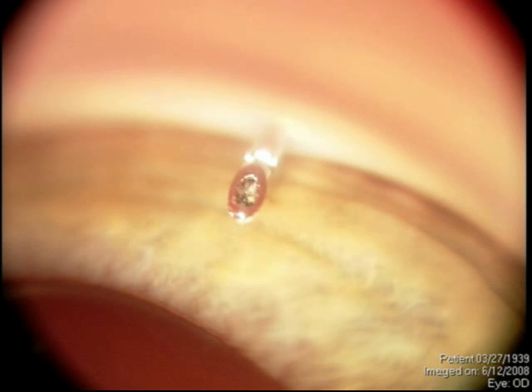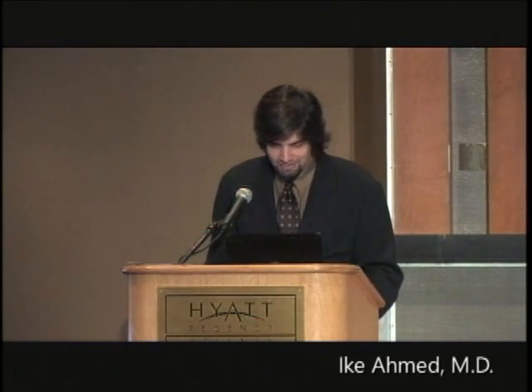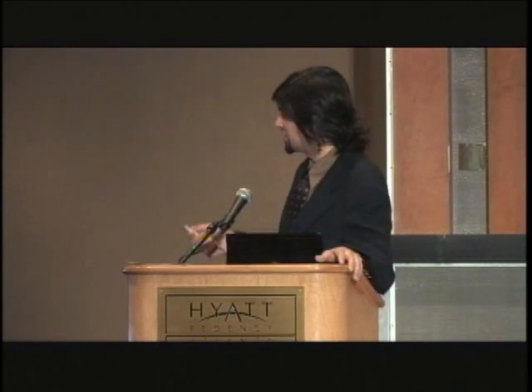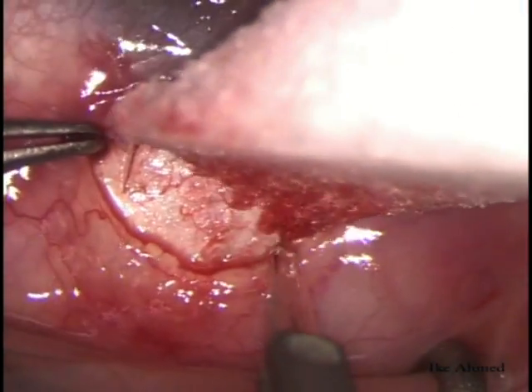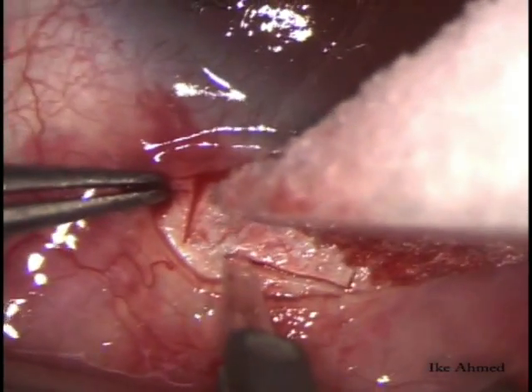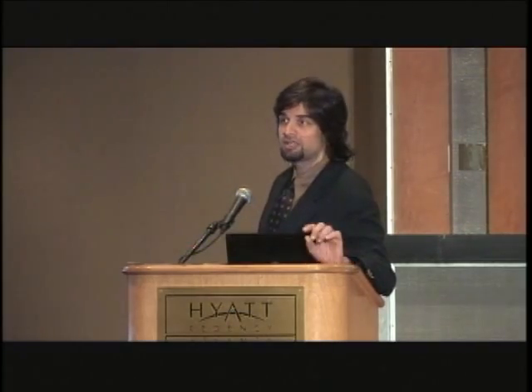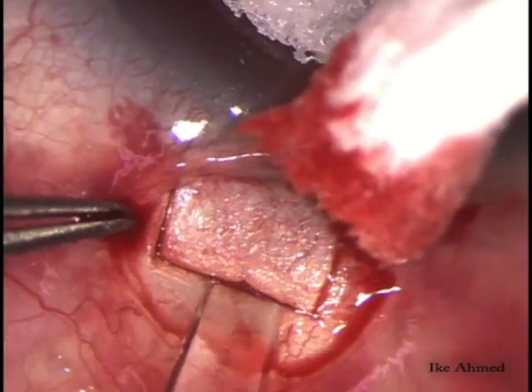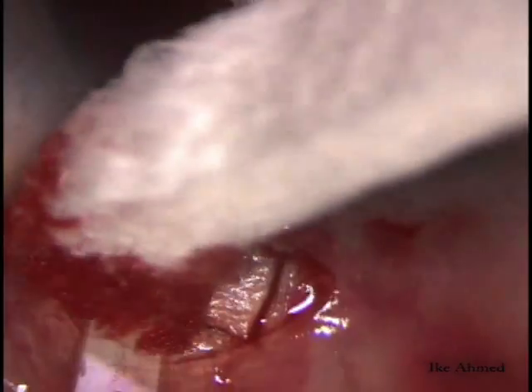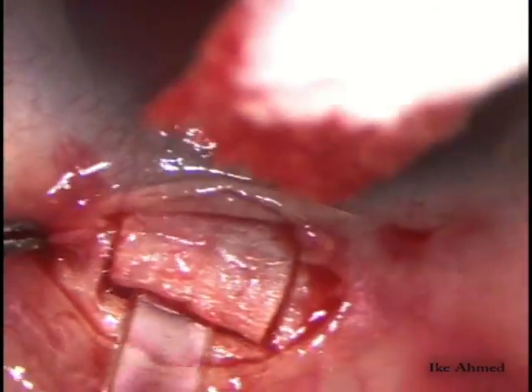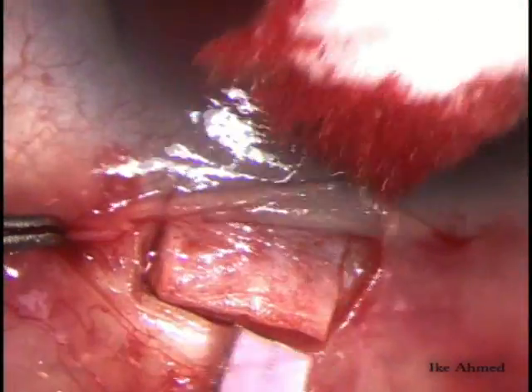I'm going to show a video clip and focus more on the pearls I just mentioned. Before the dissection, a little bit of cautery is necessary but don't overdo it. I've already identified where the spur is and where my implant will be. Scleral dissection again — approximately a four by three millimeter flap. You don't always need to measure with a caliper, but early on it's worthwhile. These are subtle considerations compared to trabeculectomy.